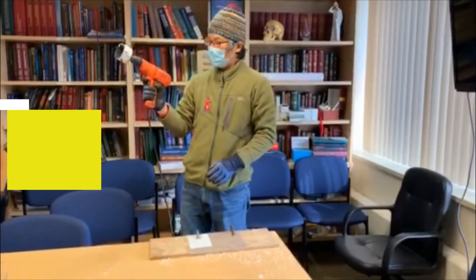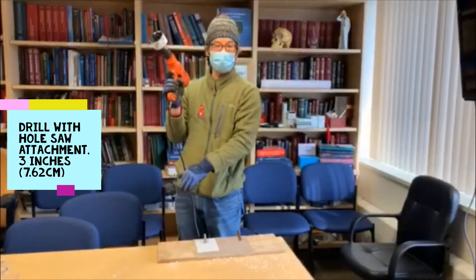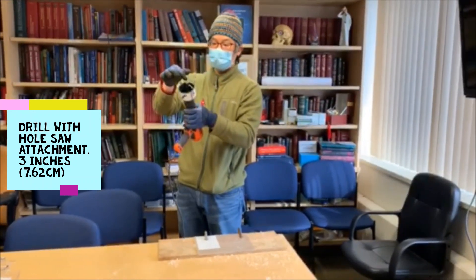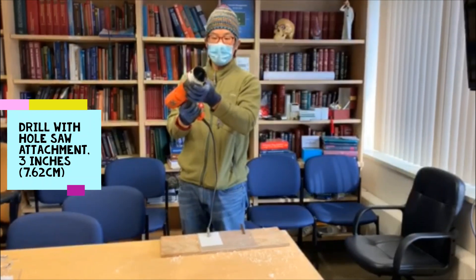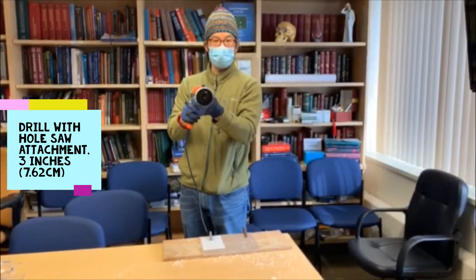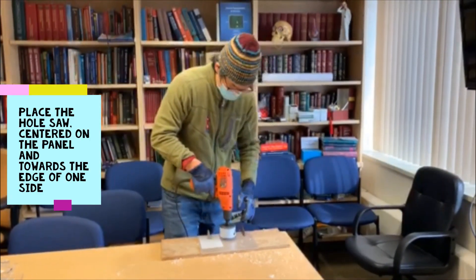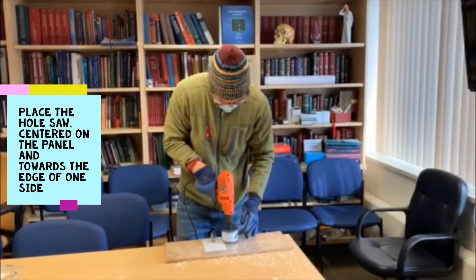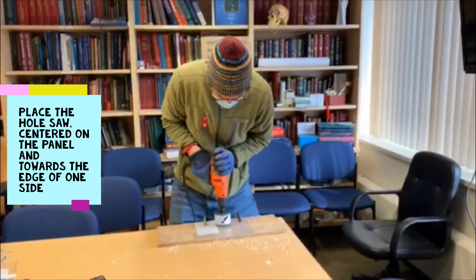I've got just a normal corded drill right here, and this is a three inch circular saw bit. We just want to make sure that we do it very slowly. I center it where I want it and then very slowly just drill through.